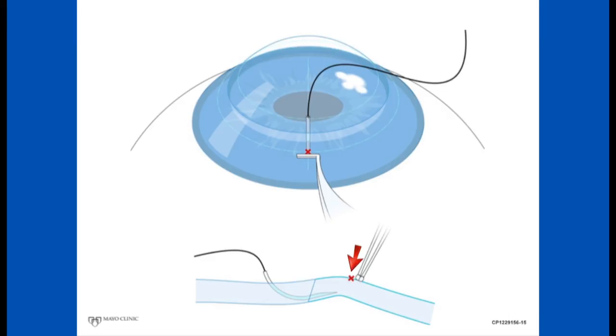Once that rotation occurs, we don't drive the needle to the surface with the needle holder. Rather, we drive the cornea into the needle with the colibri.